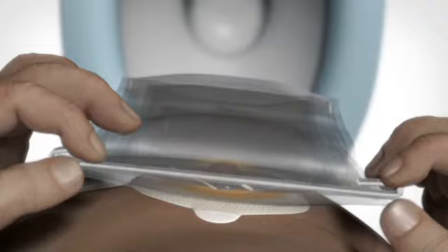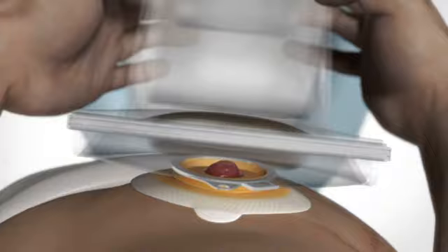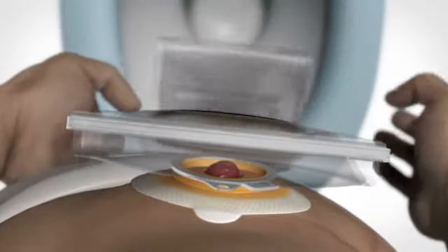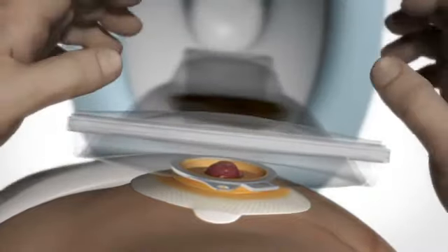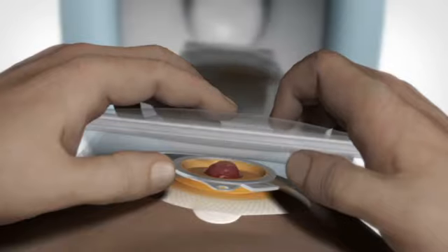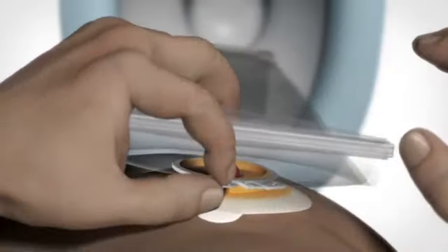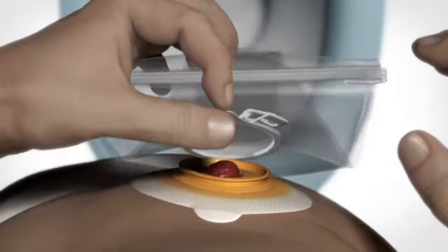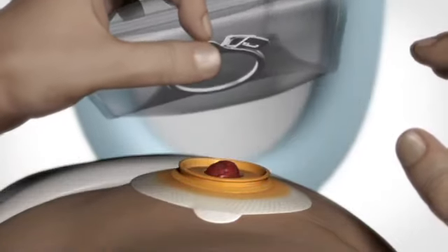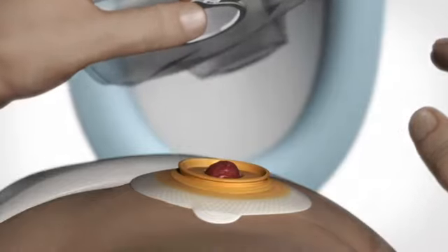When the evacuation is completed, unfold the sleeve and place the bottom of the sleeve in the toilet to empty the content. Remove the irrigation sleeve by unlocking the lock ring and gently pulling the tab upwards and outwards. Do not pull on the lock itself. Rinse the end of the sleeve as you flush the toilet. Do not flush the sleeve down the toilet.